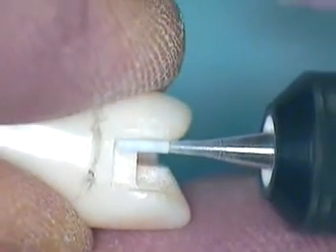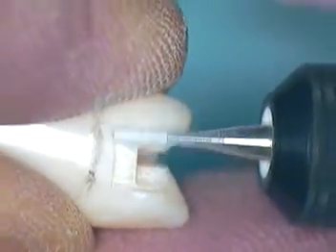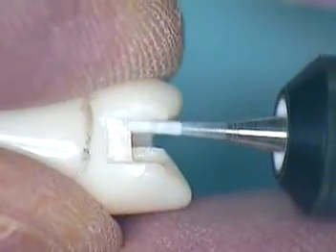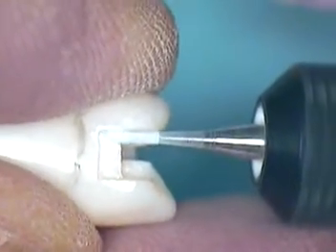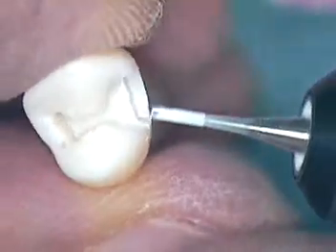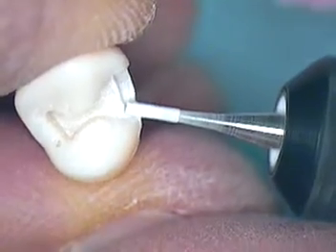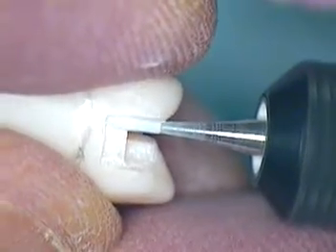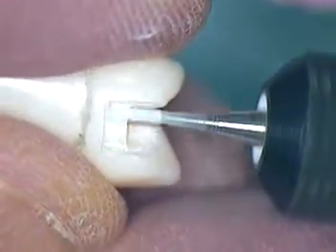One step at a time — don't get too caught up in the whole picture. I'm going off the road a little bit here, so maybe I can come down and go up and down a little bit. Let me just clean this up a little bit. I want to get this corner perfected. Maybe let's try two — take it down one notch and see if that helps with my preparation.